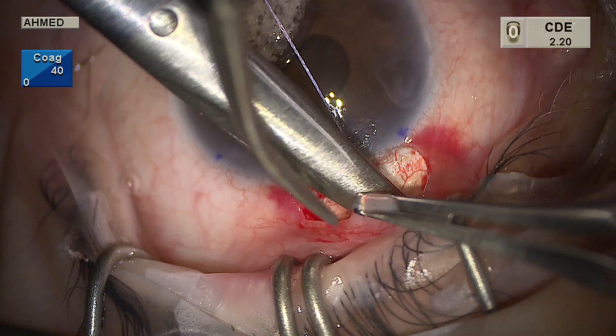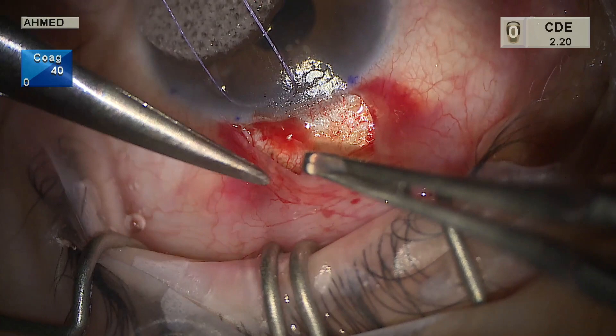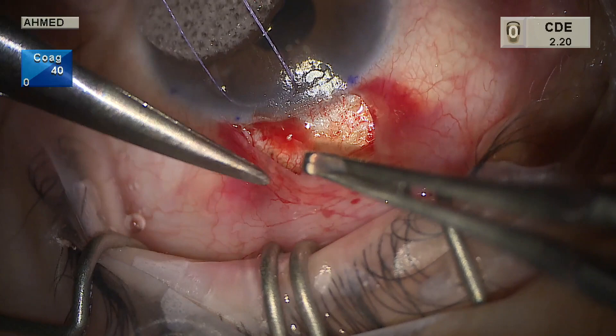Here we are nicely identifying Tenon's and separating it from conjunctiva as well. We have a nice posterior space created that will allow the mitomycin sponges to be placed and facilitate posterior filtration. The Westcott scissors are used closed, bluntly swiping left and right to open up that potential space.